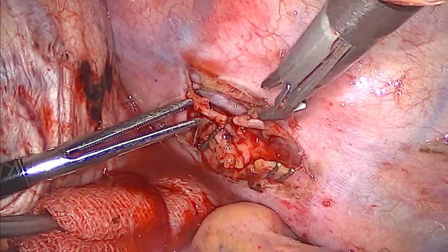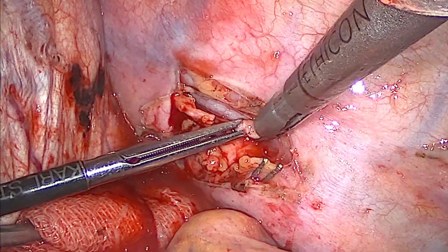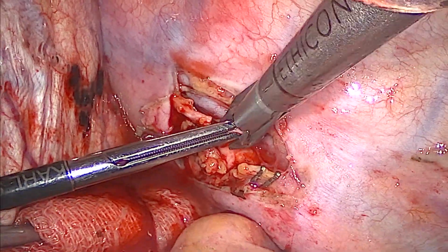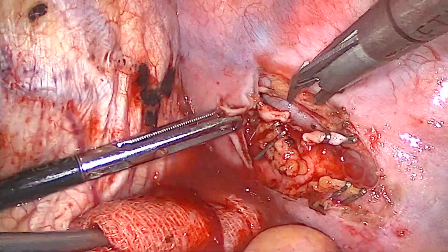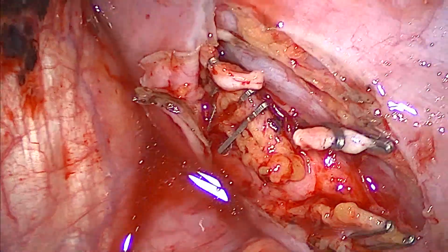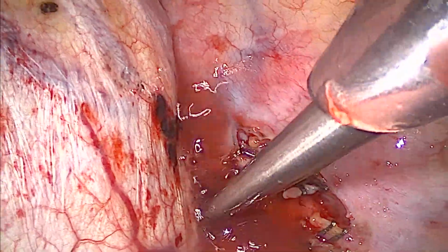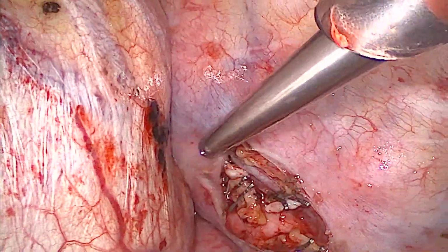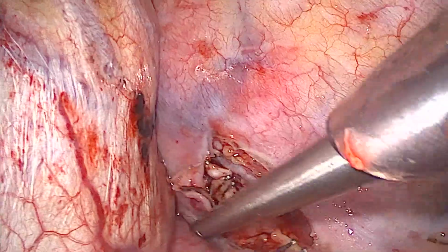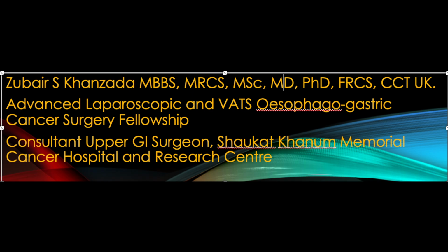Initially we tried to treat it with a totally fat-free diet. Unfortunately it was not successful, and then we put the patient on TPN, but again unfortunately it did not stop the chyle leak. So we went in by doing VATS and ligating it physically. Afterwards a chest drain was reinserted, and the patient was again monitored for chyle leak, and we were extremely lucky in this case that the chyle leak stopped. The patient went home a couple of days following the surgery.